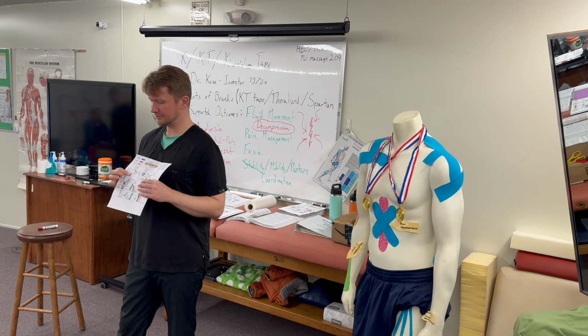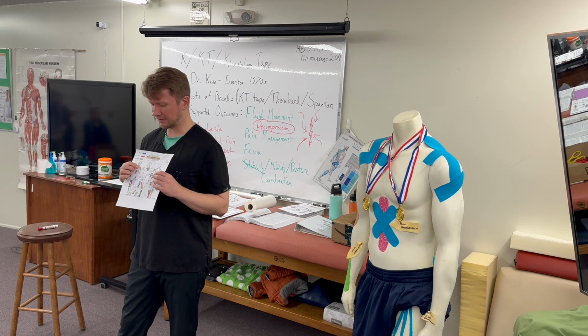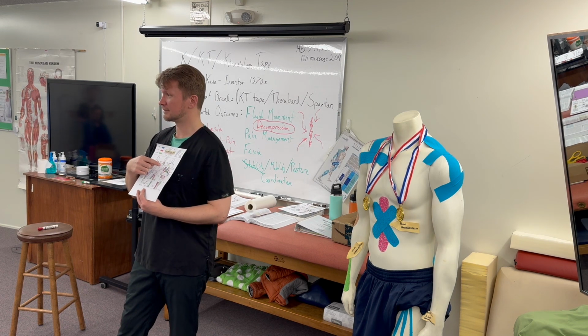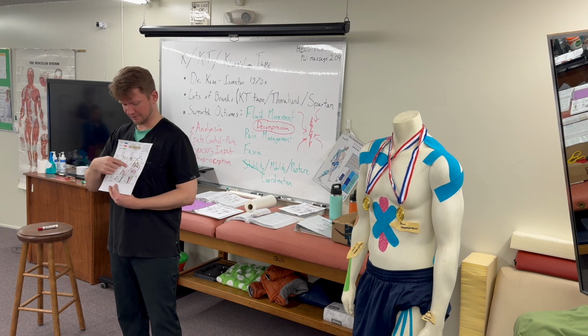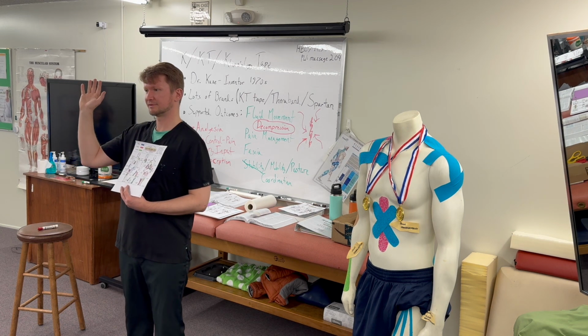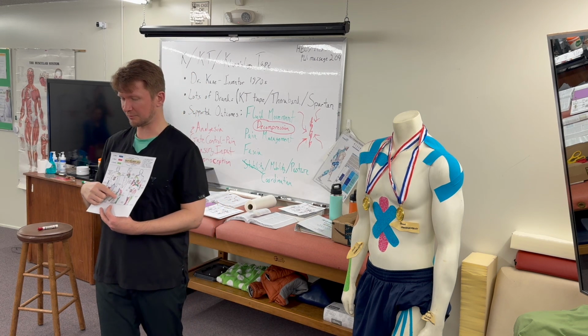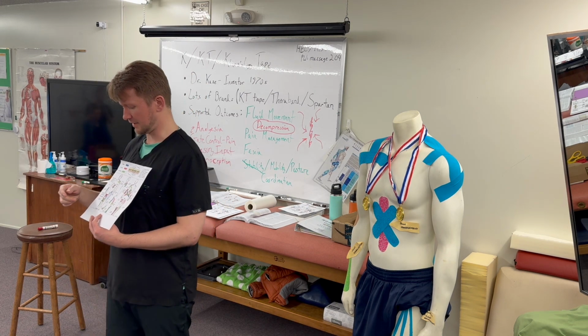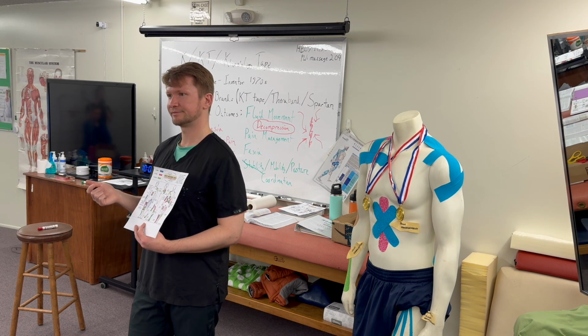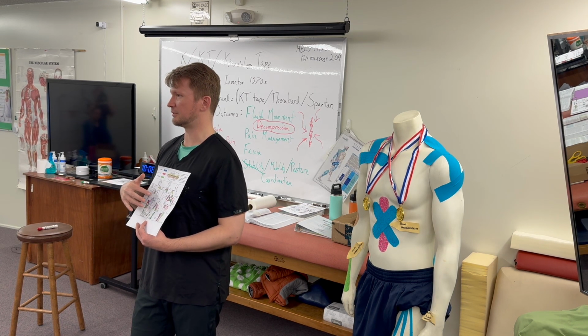It's easy. The ones that we're gonna practice more are gonna be the more complicated joint ones. We're gonna think about the easier stuff, which would be an elbow or a wrist. Those are the easiest. Then we get more complex with the feet, and then we get more complex with the knee, and then the most complex probably is the shoulder. So those will be the ones I demo when we practice.